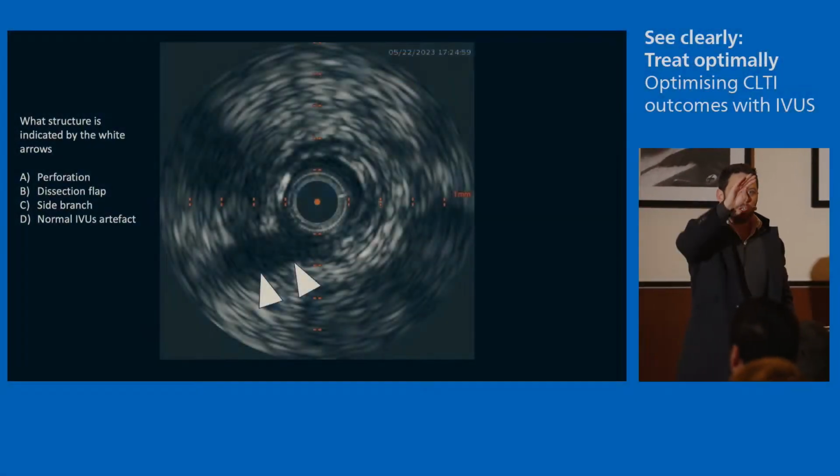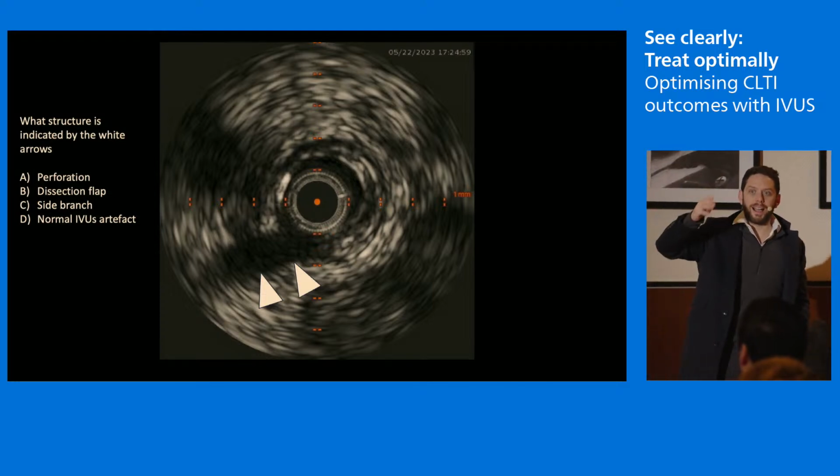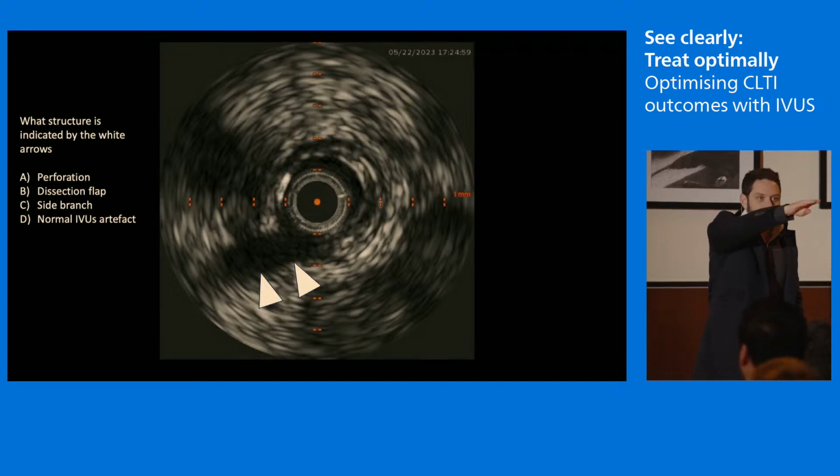It's actually really useful if you want to tag your fluoroscopy images from the angiogram to where you are exactly in space in IVUS. A nice example is if you're trying to find the origin of the peroneal artery and you're down an occluded TPT, you can see where the PT or the TPT peroneal AT come off as you go through antegrade and retrograde and pull back. You can actually see the origin of the occluded or sometimes side branches. You then do your angio and go, right, that collateral is at that point in the fibula. I will draw on the screen, and with the Philips system, we have an integrated system, you can draw a line and say that's exactly where I expect to find my peroneal.